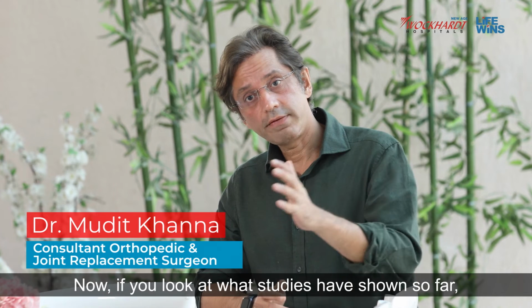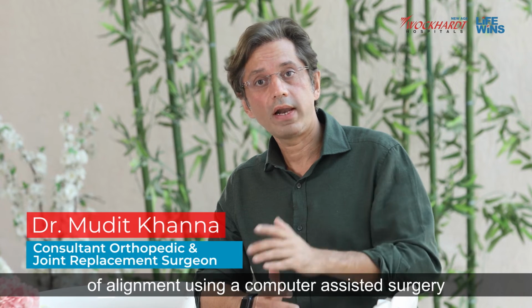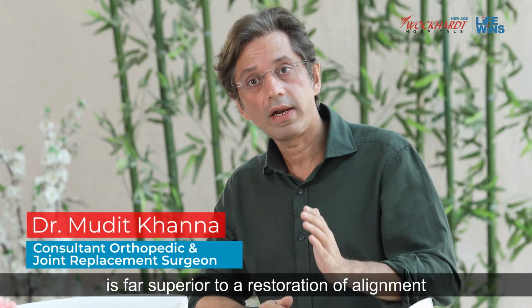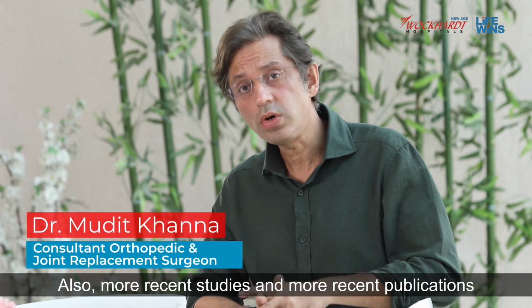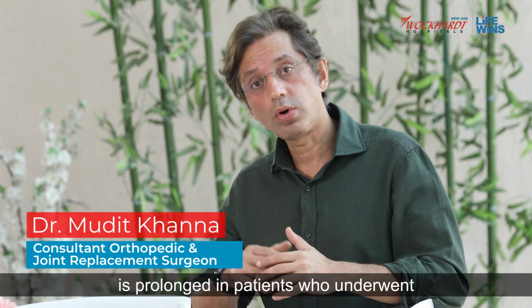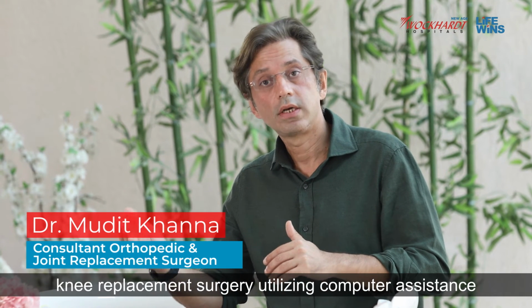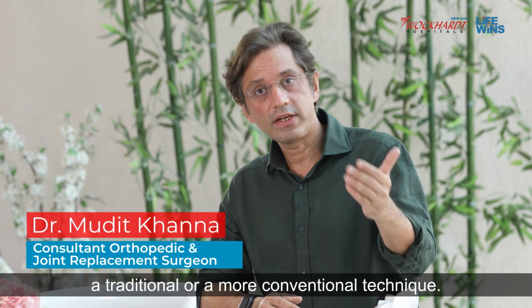If you look at what studies have shown so far, multiple studies have shown that restoration of alignment using computer assisted surgery is far superior to restoration of alignment when a traditional or conventional technique is used. Also, more recent studies and publications have shown that the longevity of the implant, or the need for revision, which means doing a surgery again, is prolonged in patients who underwent knee replacement surgery utilizing computer assistance versus patients who underwent the surgery utilizing a traditional or more conventional technique.